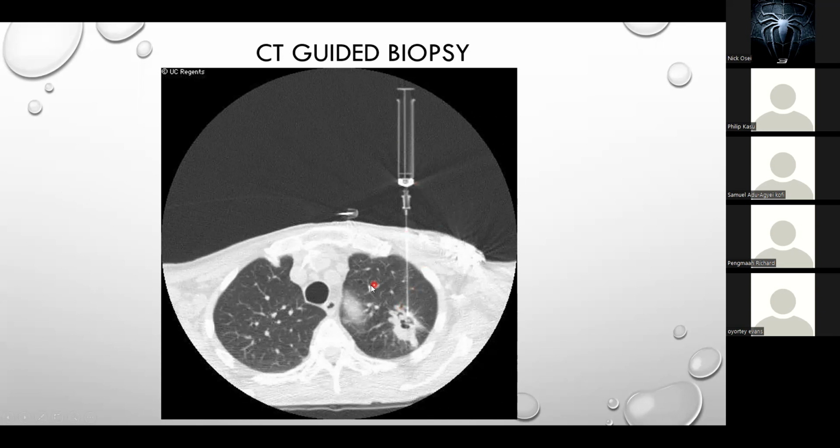So they put the patient in the CT machine, and then they're able to pass the needle right through into the tumor. Can you appreciate the syringe and needle so that they can take a biopsy of the tumor? So that's also an application of CT scan. Yes, CT guided biopsy will look like this.